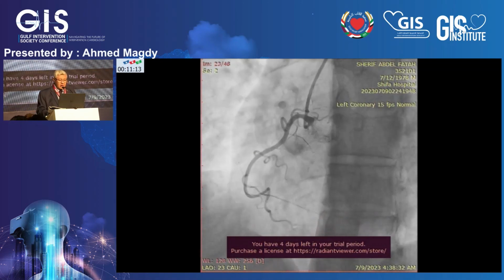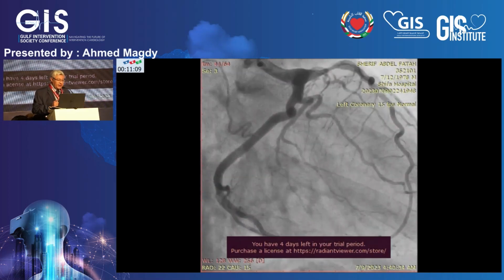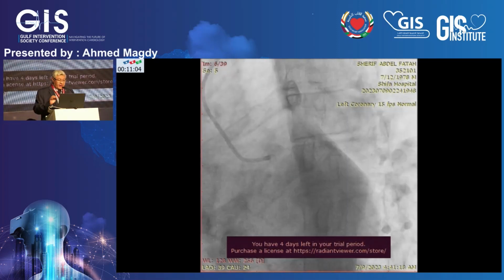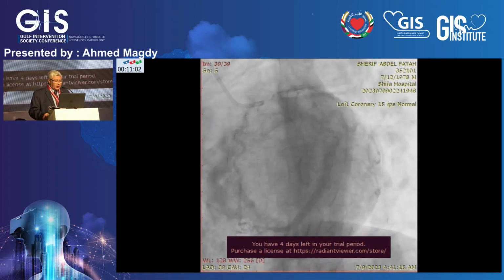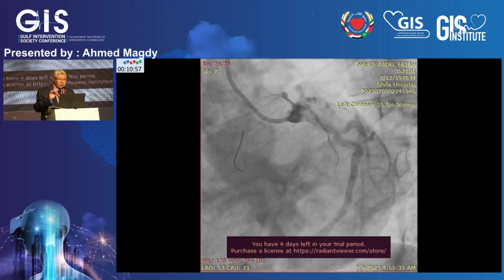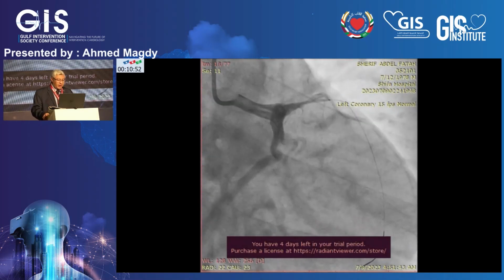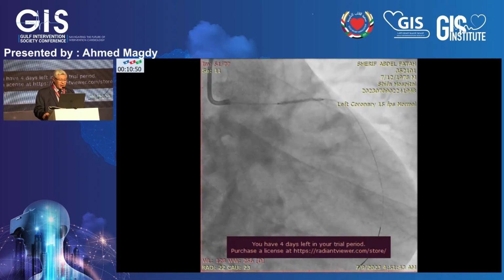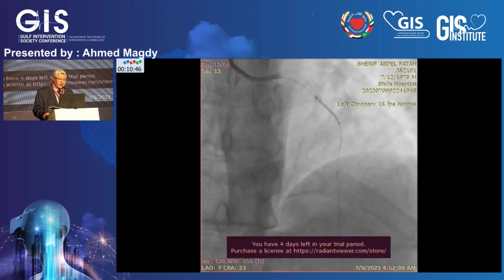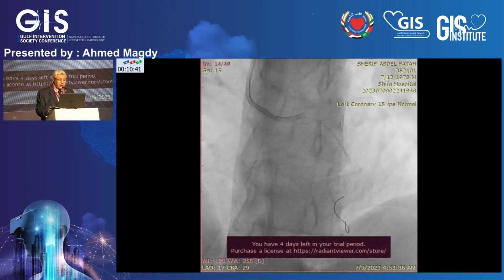This is another patient. He's 42 and he had a stress test 3 days earlier that was negative, but he had acute infarction. The technical part is that the LAD is huge compared to the left main, and so you have to technically land the stent at the edge of this ectatic area, otherwise it will be floating in the LAD and in the left main. So always take much more consideration for the symptoms and don't rely on only one test.